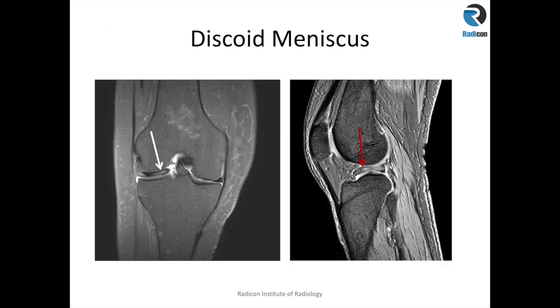Discoid meniscus is where the meniscus is quite thick, has an abnormal shape, and almost covers the whole width of the tibial condyle. The lateral meniscus is most commonly involved, and these tend to undergo early degeneration and can have tears due to altered biomechanics and abnormal stress. If the signal change is intrasubstance, label it as myxoid degeneration. If there is blunting, truncation, or the signal reaches the articular surface, describe it as a tear using the same nomenclature as for a normal meniscus.